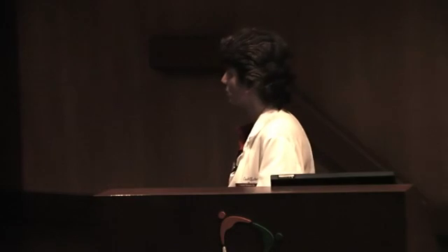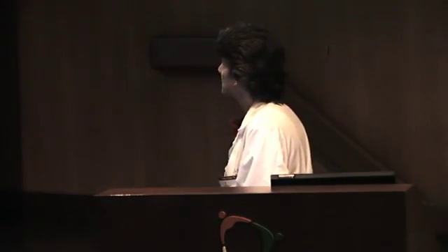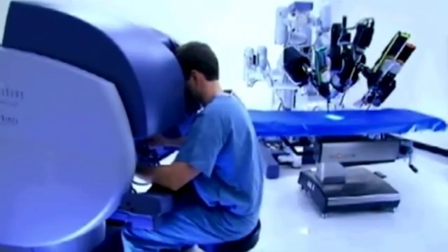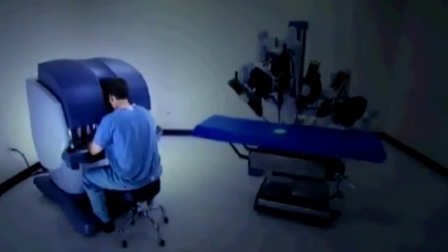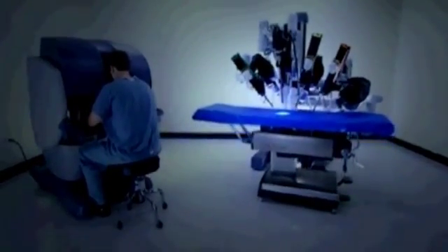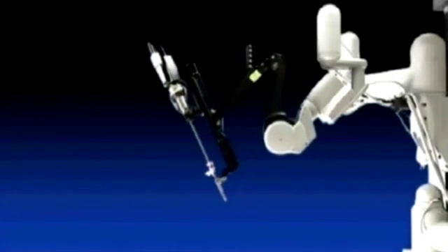I wanted to show you this brief video by the company because it gives you a good idea of how this works. I'm going to talk a little bit over the audio because you don't need to hear that. So the patient would be obviously lying over here. The surgeon's very comfortable over here, usually freezing to death, sitting underneath the air conditioner. The ORs are kept very cold, so I actually usually wear a warming jacket because it's freezing without our surgical gear on.